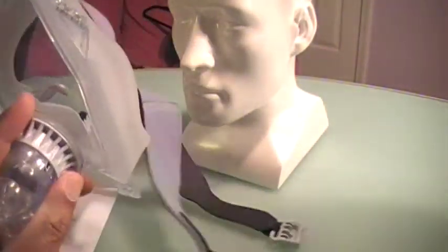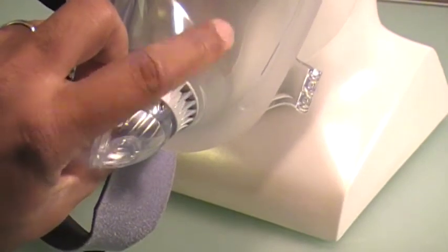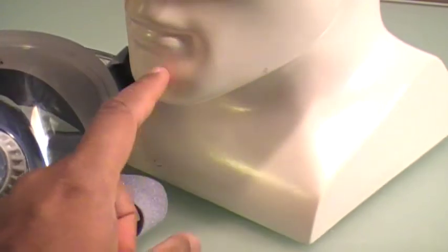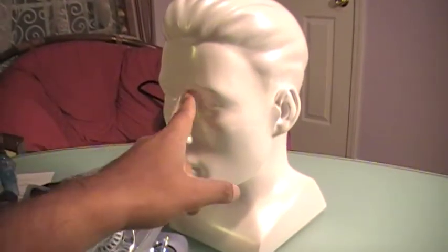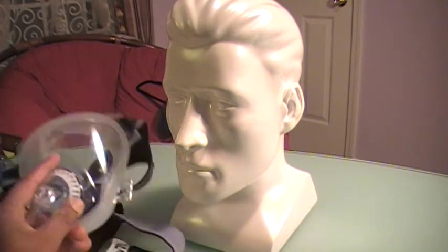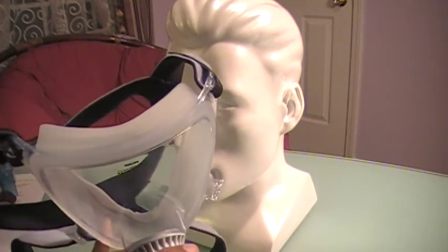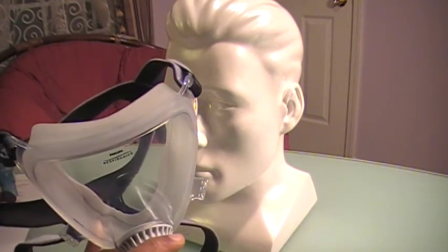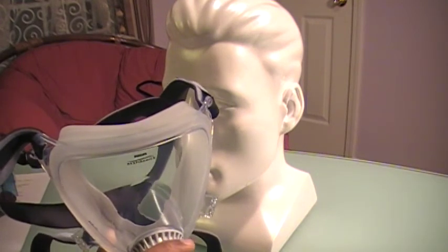Another problem is drooling, because this mask covers both the nose and mouth. If you're someone who drools a lot, that can be uncomfortable. Personally, I tried it out for two nights and my eyes were a factor — they were drying out within minutes. Two or three other patients have complained about the same issue. Finally, you can actually hear yourself breathing in and out with this mask, which made it hard for me to fall asleep.